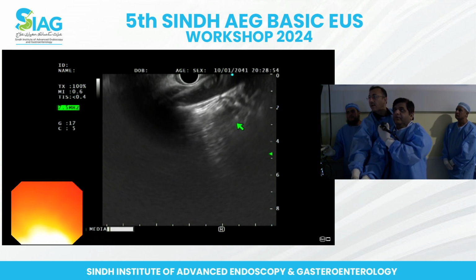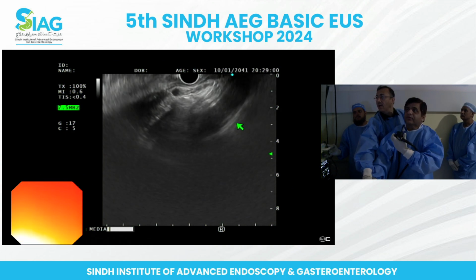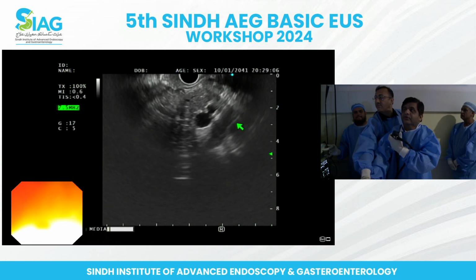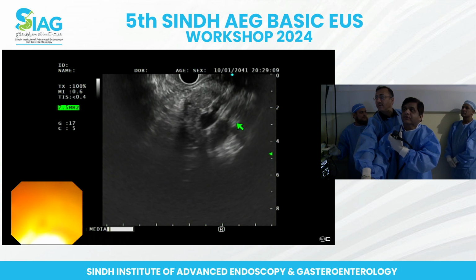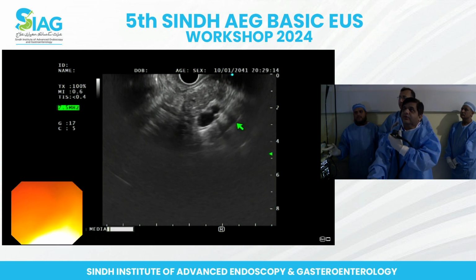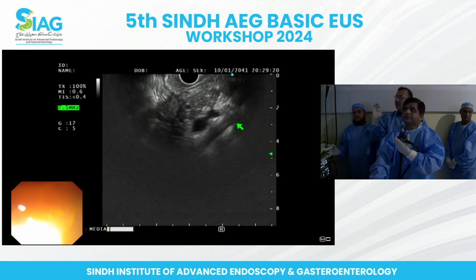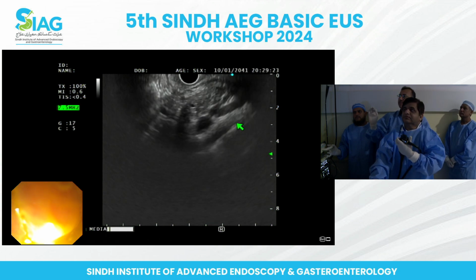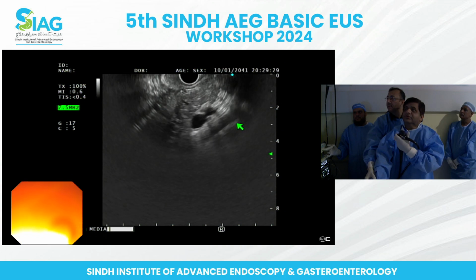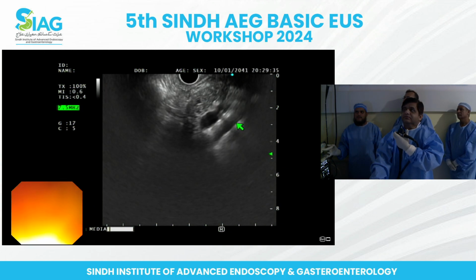There you see, and slight jiggling movement. Okay, sir. And there you go, at the pancreas, right? Once at the pancreas, you need to once again identify the pancreatic duct. Learn to identify your landmarks. Unless you are identifying the landmarks, you are going to get lost very quickly. As a beginner, it's very important to jump from one landmark to another landmark and make your assessment as per the landmarks. No random assessment needs to be made. So bring the pancreatic duct underneath your transducer, and now once again start turning clockwise, big wheel up and slight pullback.